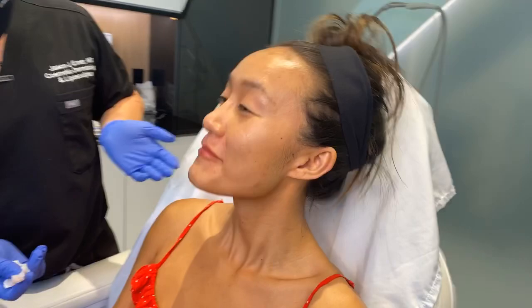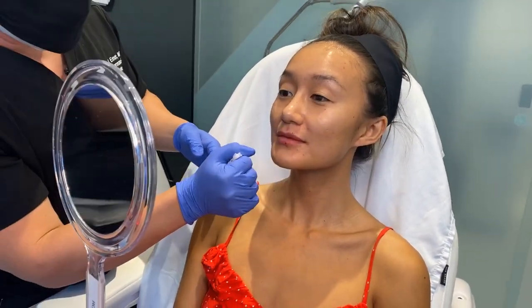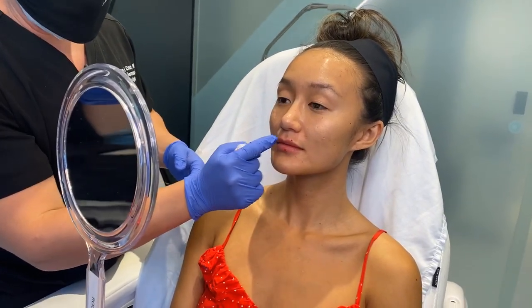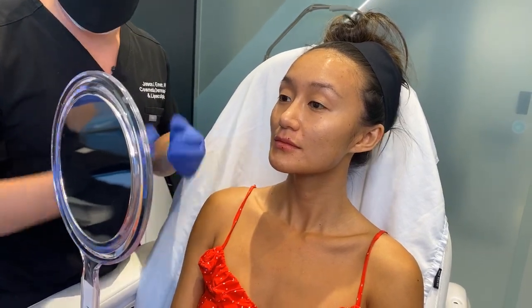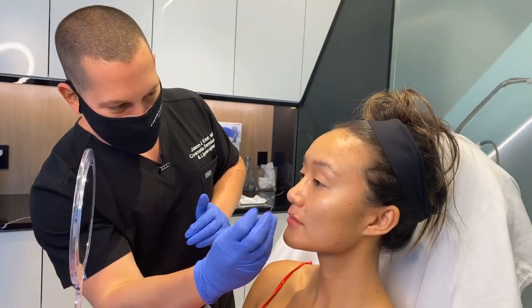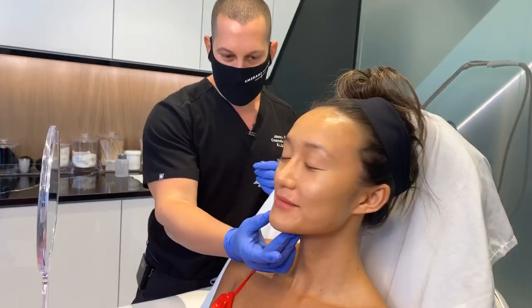Now you have volume. Come close for a sec so that you can see. We created a little more shaping on the Cupid's bow, two-thirds bigger volume in the bottom to the top, and then some definition throughout. We don't want to extend her lip too wide, you guys, because her mouth is a little bit closer together, so you don't want to extend her face. We kept her natural shape so that it blends well, so turn from every angle. What do you think? Oh, I love it. I actually have a little upper lip now.